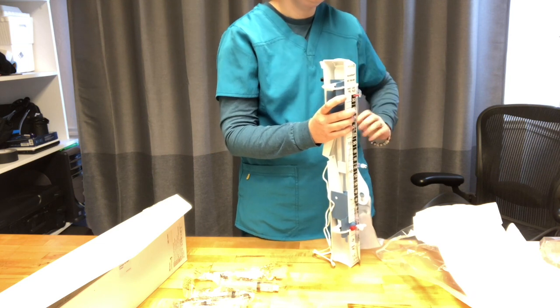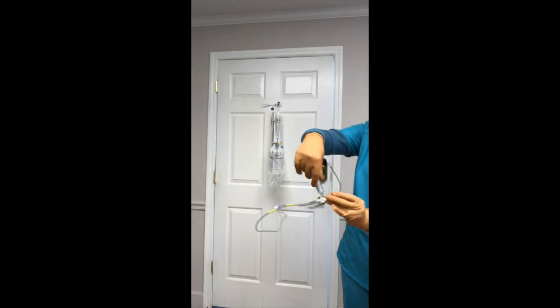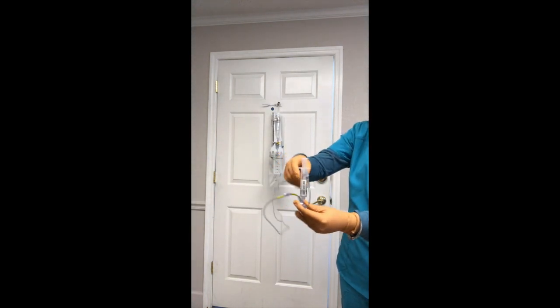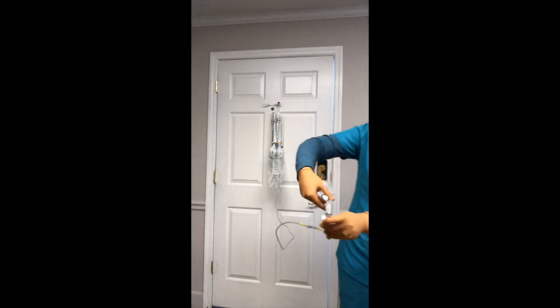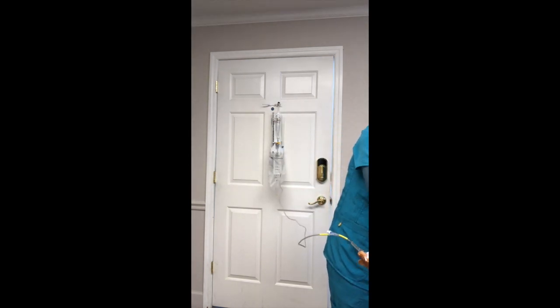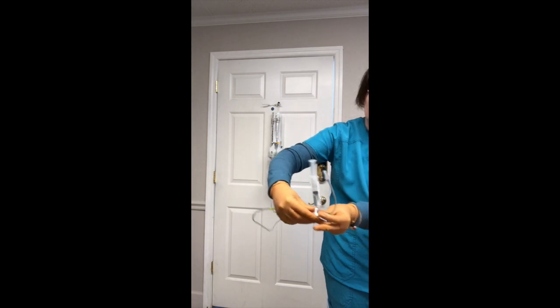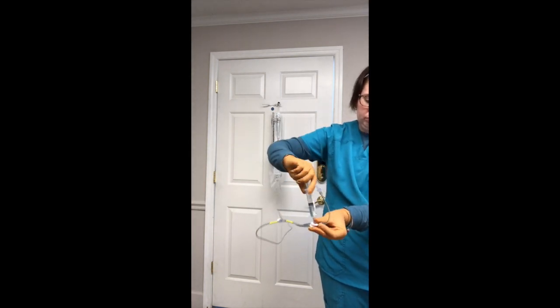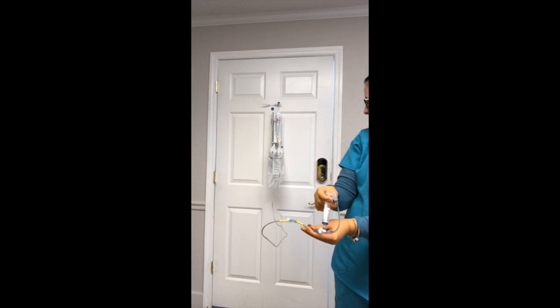Your next step will be to prime your tubing. Prior to priming tubing, you will place a mask on your face and don sterile gloves to preserve aseptic technique. Then prime tubing from the pressure transducer stopcock, first toward the patient, and then toward and all the way to the burette. Tubing must be primed with preservative-free saline to avoid any reactions with contact with the CSF.